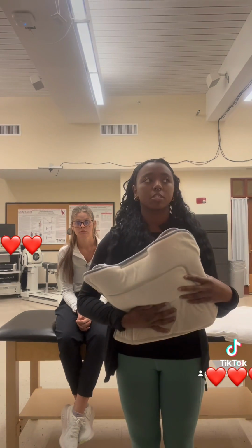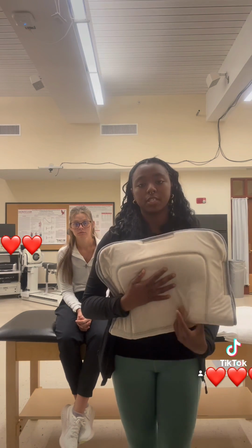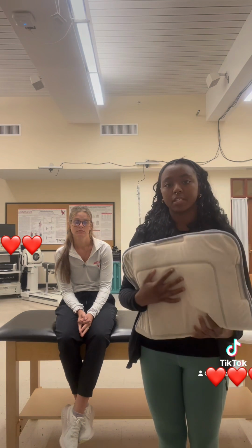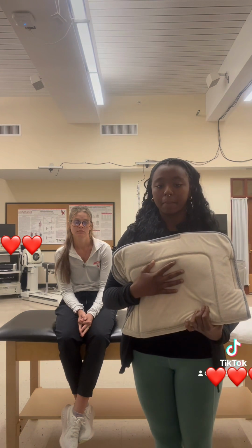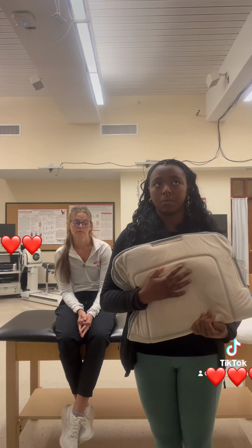Before providing treatment, I would evaluate the patient's goals and make sure the pathology being treated is actually aided by superficial heat. This patient has chronic back stiffness, therefore this will work and will not cause any adverse effects. To begin, I would explain to the patient what modality I'm using, how the modality will benefit them, and that this is meant to relax your muscles and help with muscle improvement.